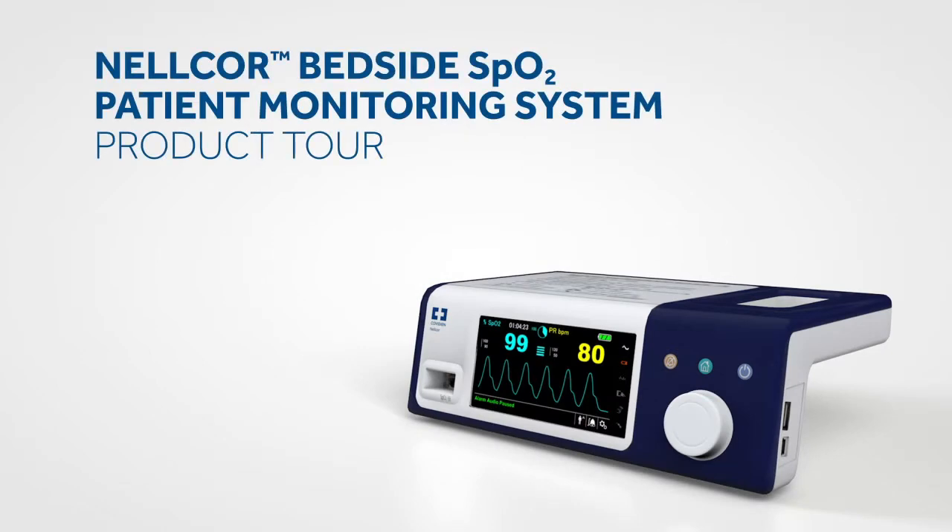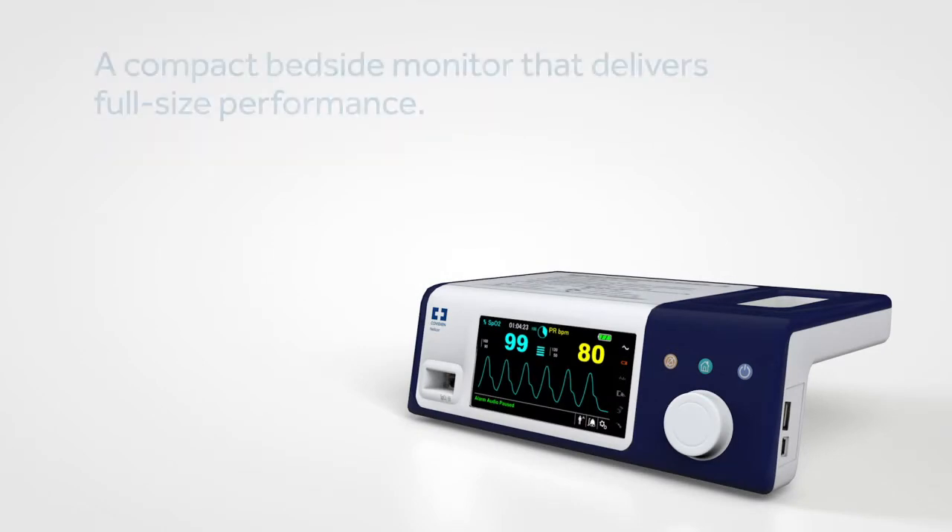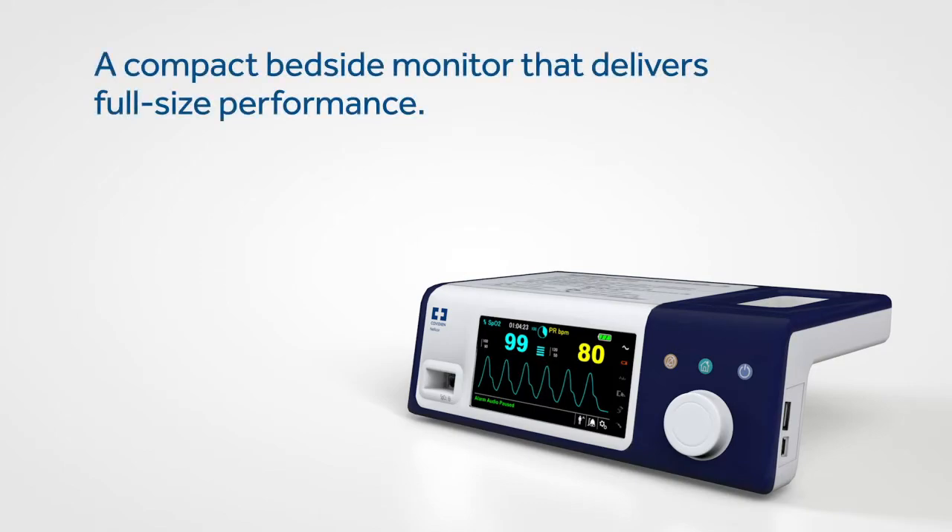The Nelcore bedside SpO2 patient monitoring system provides clinicians with access to the most critical information regarding their patient's respiratory status.